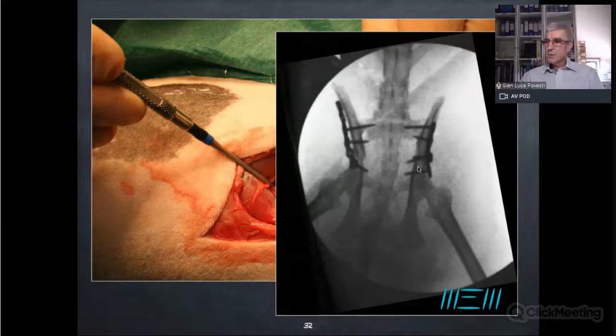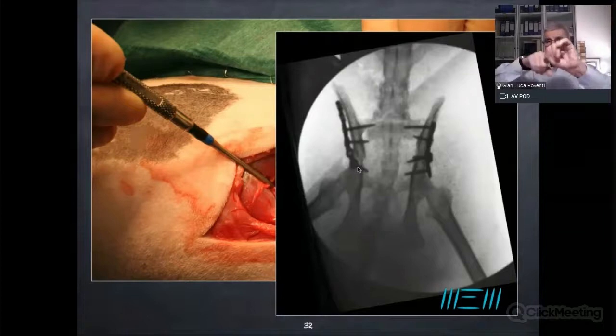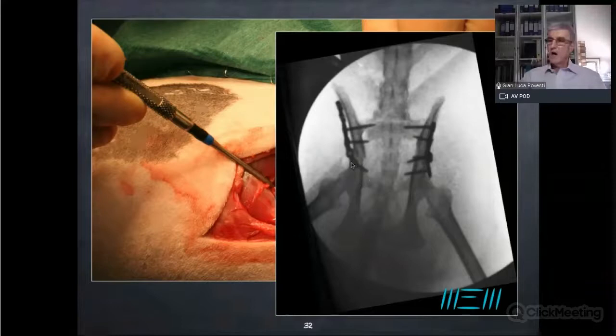The problem here was that we have room enough just to place one screw on the right side, on the acetabular component of a fracture on the right side. And this can be tricky if we don't stabilize the overall pelvic fracture. Why? Because if the dog is weight bearing, he will load this area, and with just one screw here, it will perform this kind of torsional instability along this screw. This will be very likely to promote mobilization of this part, okay?